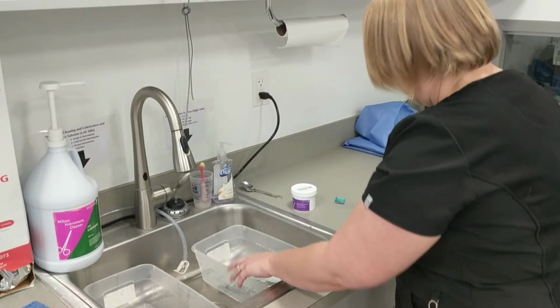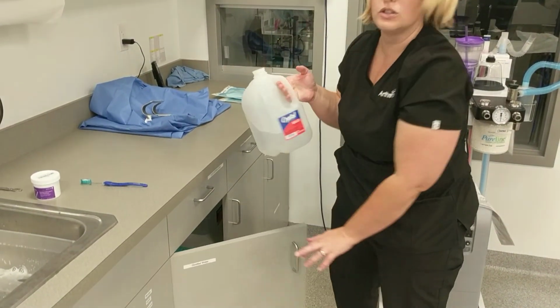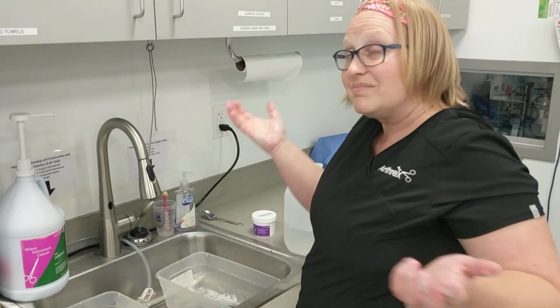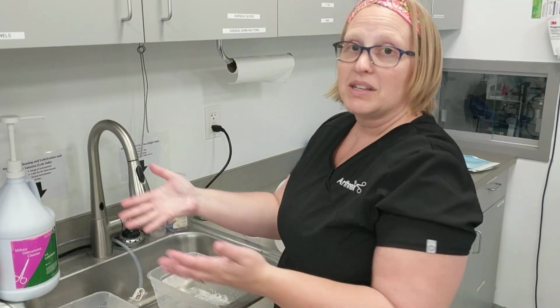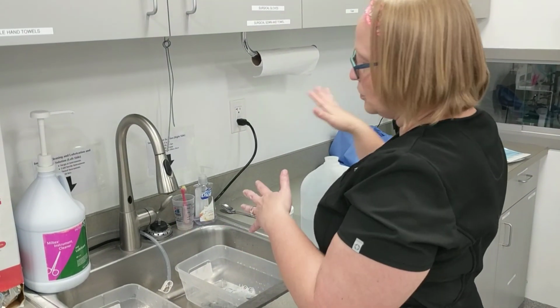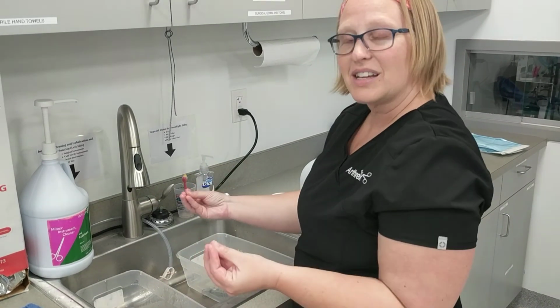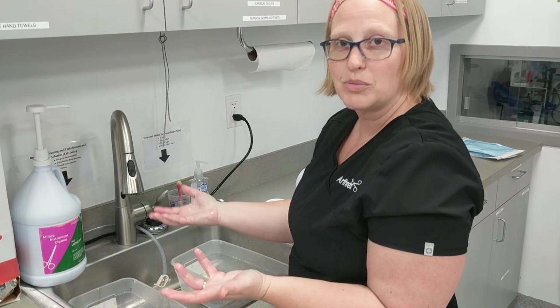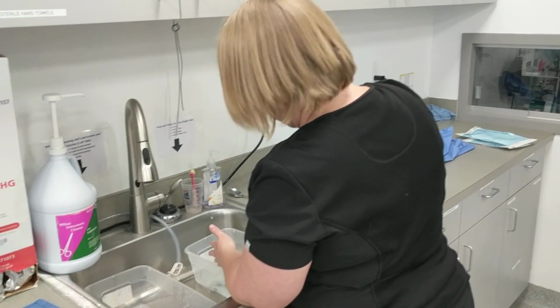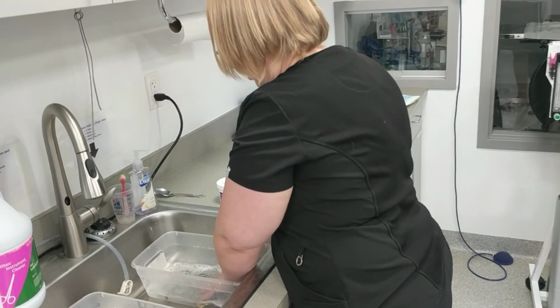The other thing I'm going to do is reach right underneath here and get some distilled water. Using tap water to rinse the large debris tends to be okay because I am putting it now in a proper cleanser and a lubricant. I don't want to use plain tap water in my bucket from there because I don't want that water to harden. Sometimes you have hard water, things like that. Distilled water is really ideal, so I'm going to add that to my instruments and my lube cleaner there.